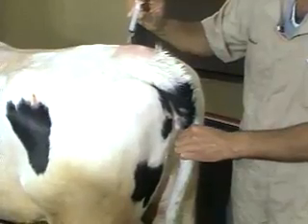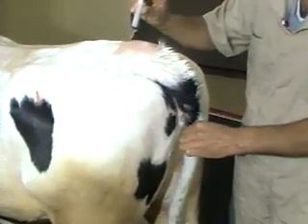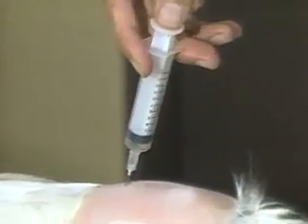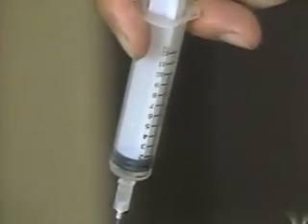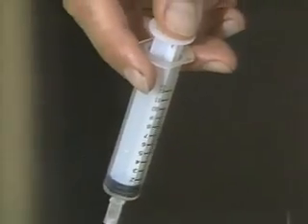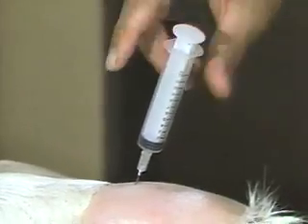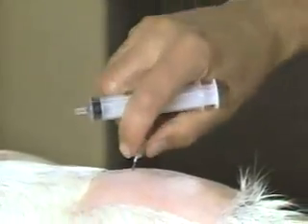This plunger should almost fall in. In fact, one other test is when you're pushing on the plunger of a disposable syringe, you shouldn't blanch your thumbnail — or you're not in the right spot. There it went in. Then you withdraw the needle.